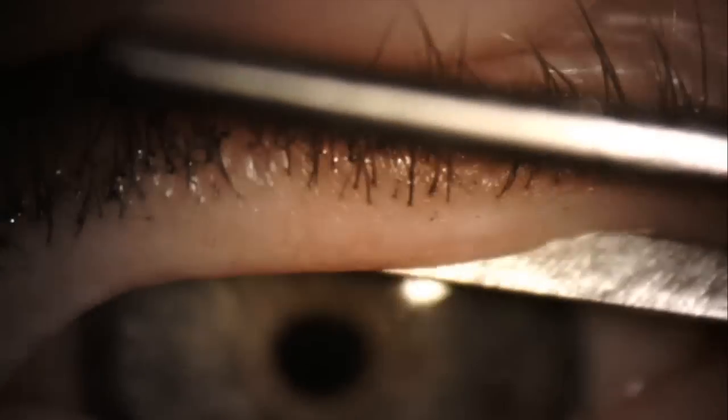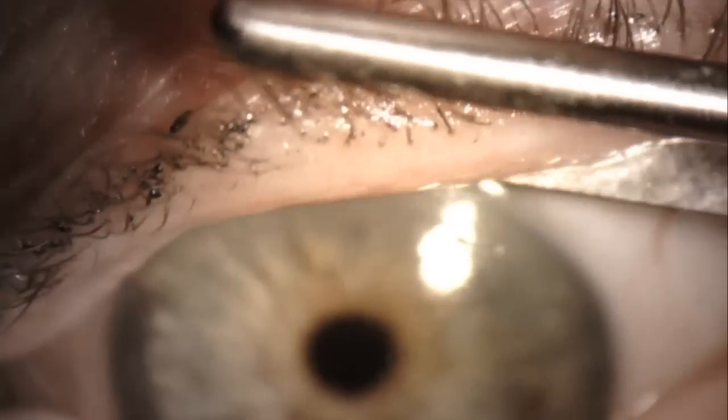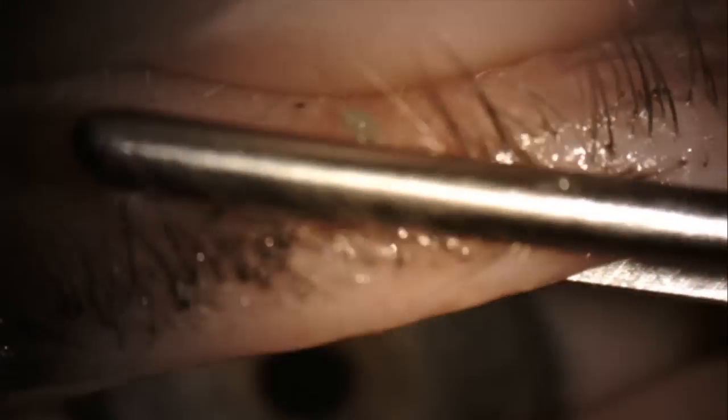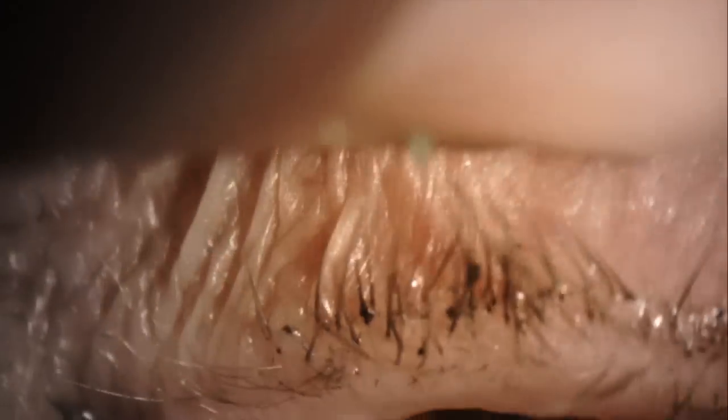And again, above the root of the lashes if possible, not so much there, but then gradually compress towards the margin there. At that point, I tried to correct myself. This is a little bit more sensitive and ergonomically more challenging. And now attention is turned towards the nasal eyelid, and compression again from the fornix towards the orifices. So if you can think of it in three zones, nasal, central, and temporal, and then progress from the fornix towards the eyelid margin. So the upper eyelid has been treated.